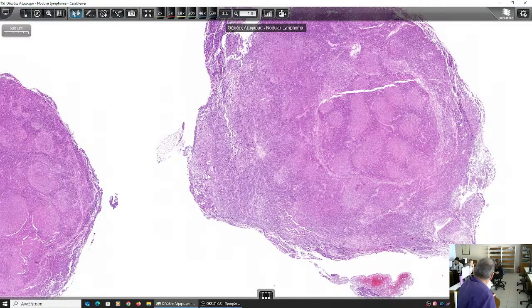This may be invasion, because you see lymphocytes entering the adjacent adipose tissue. Why? If they are malignant, you can explain it that they invade the surrounding tissues, like all malignant neoplasms do. How are all malignant neoplasms diagnosed? Atypia and invasion, generally. We're talking generally now. That might be the case here. So it does not prove that it is invasive, but it makes you suspicious. So now, we have this suspicion. Let's go in the lymph node and see if there is something wrong in the lymph node.